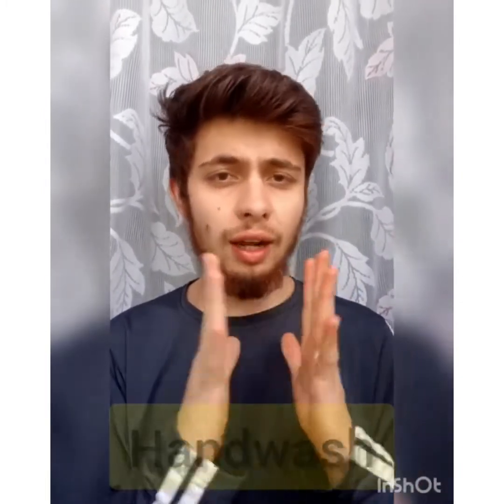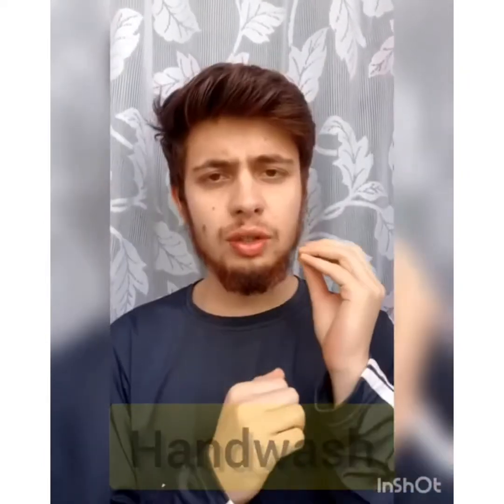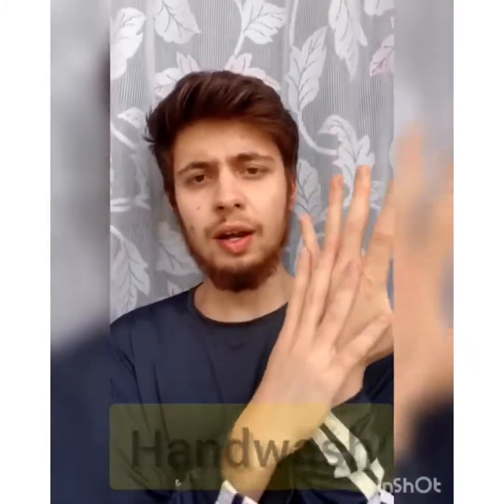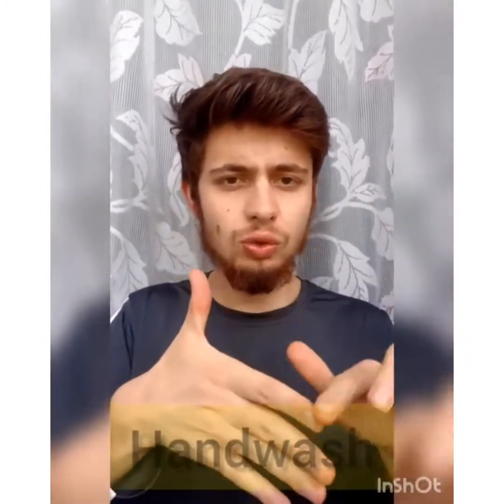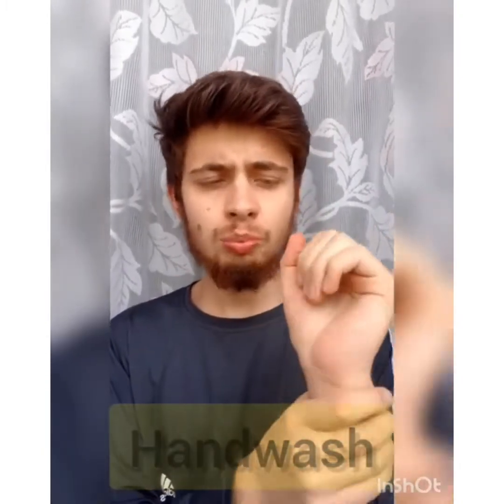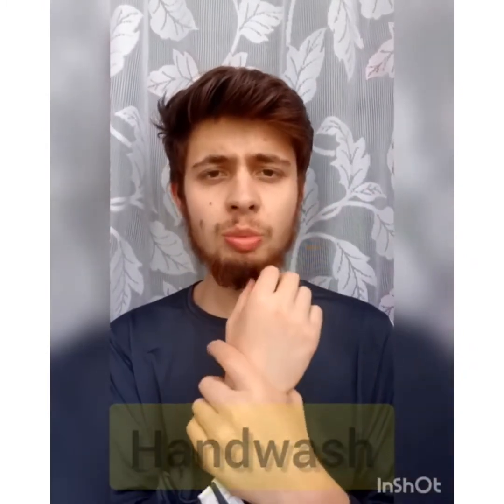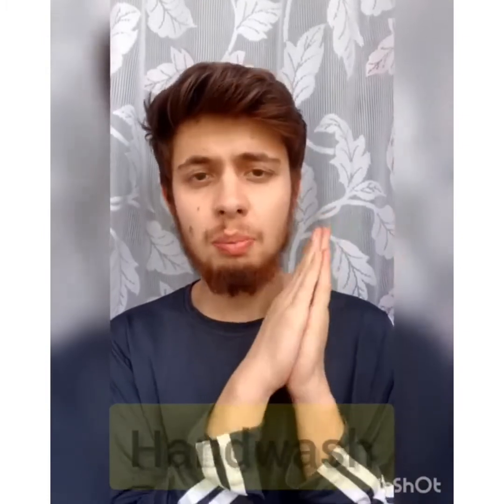But before giving any type of medication, we should first sanitize our hands. We can also wear gloves, but it's better to clean our hands with the help of a sanitizer. When we use a sanitizer, we clean our hands this way, and then we clean the back of the hand also like this, and then the right hand also. Then we should also clean this surface, thumb rotation. And lastly, people usually forget this, the wrist, so we should also clean our wrist before giving any type of medication, before touching the patients.